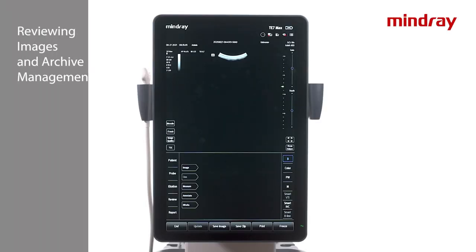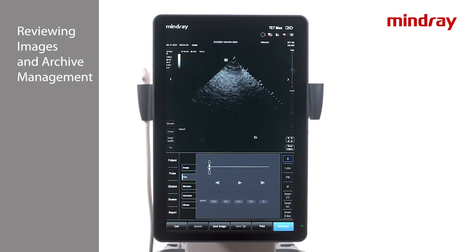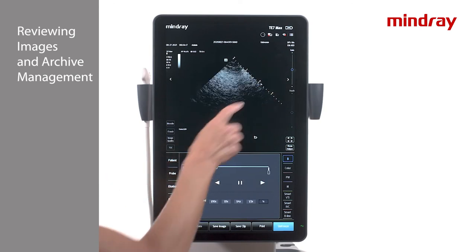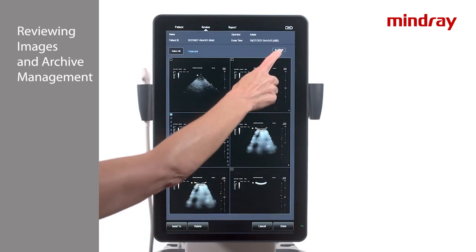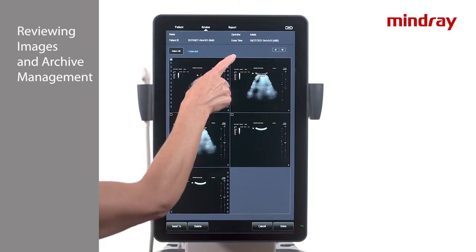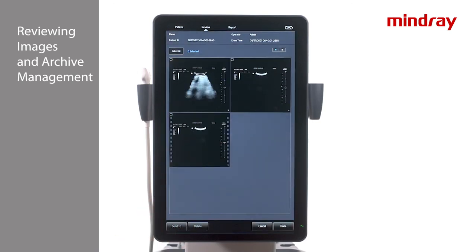Once all desired images have been stored, select the Review tab. Images may be selected for full screen review by double tapping the desired image. To scroll through the images and clips taken, select the arrows on each side of the review screen. To change the number of images viewed from the main screen, select the grid view button. Images may also be deleted from this location by selecting the image and choosing delete at the bottom of the screen. Post processing features are available, such as adding annotations or measurements during review as well.